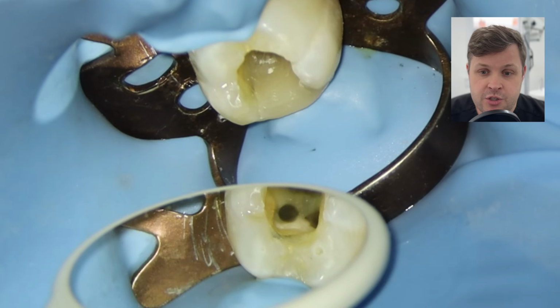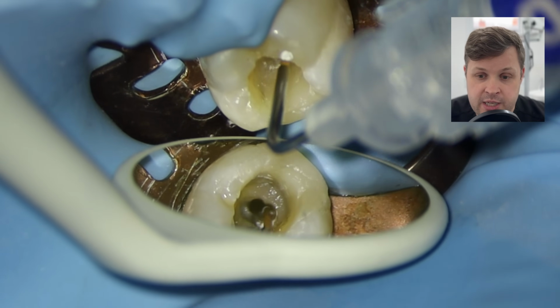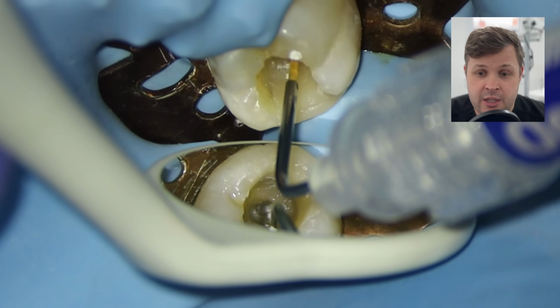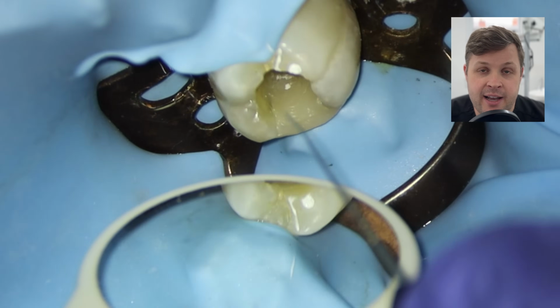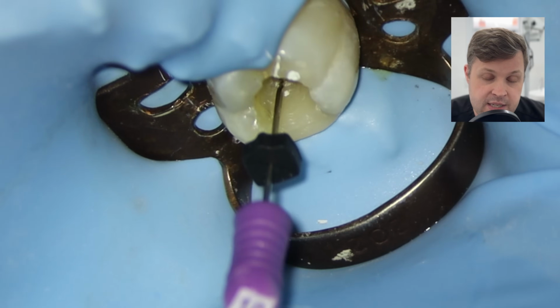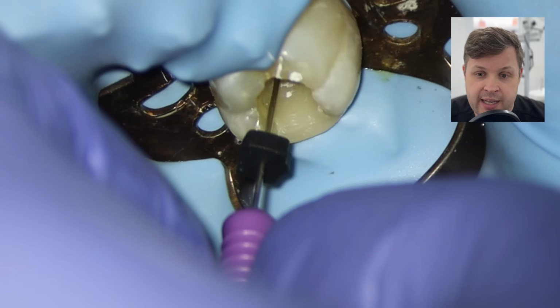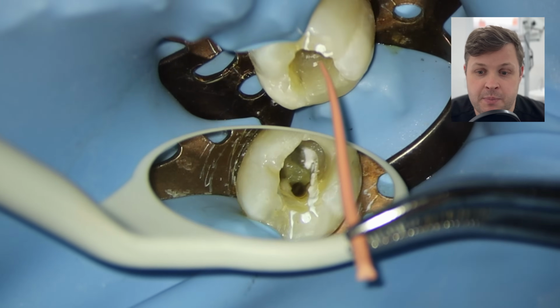And the obturation's super predictable now. We're going to use this one fill with these visco tips. I'm going to fill the distal canal quite significantly, really, because there's a lot of space there. And then I'm going to use a size 10K file to length, and this pushes the sealer to the apex, and it also stops any air bubbles or any vapor lock that may occur as we push this GP cone to length.